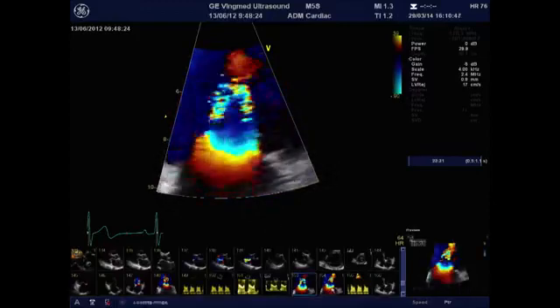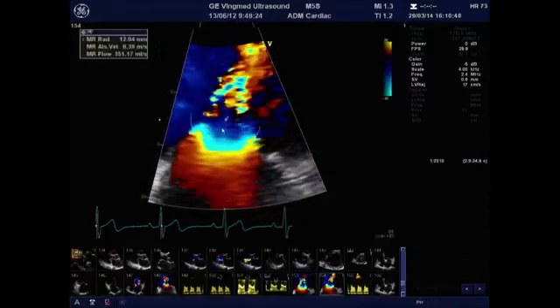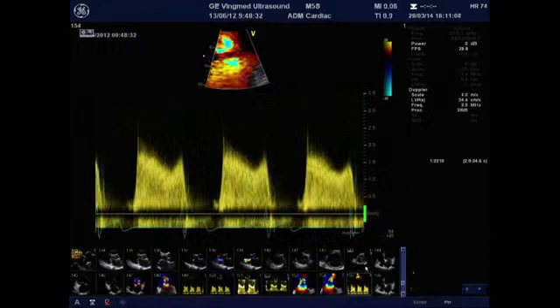And then what you have to do is just to stop your frame in mid-diastole, in the frame in which you clearly see the neck of the vena contracta and the very nice PISA radius that I have measured here as 1.2 centimeters, corresponding to an aliasing velocity of 39. And by also knowing the velocity time integral of the continuous Doppler flow, you actually can derive the functional mitral valve area.